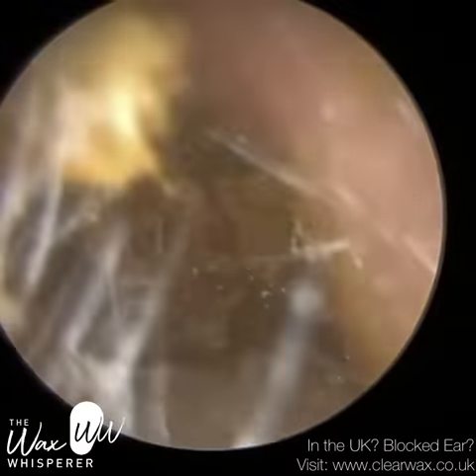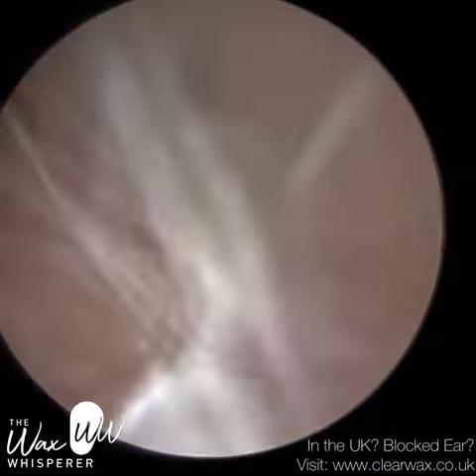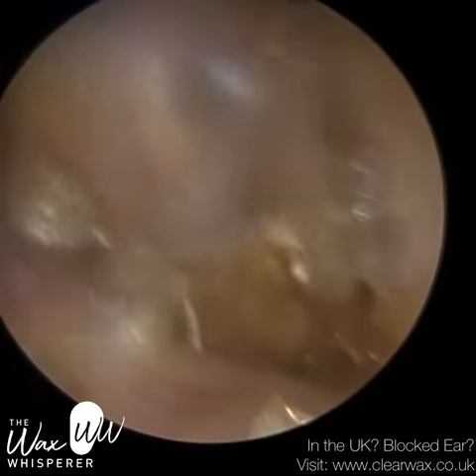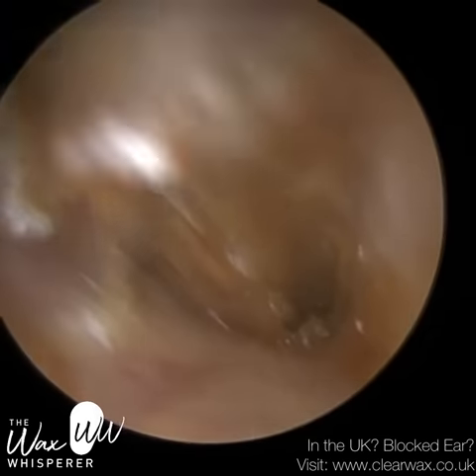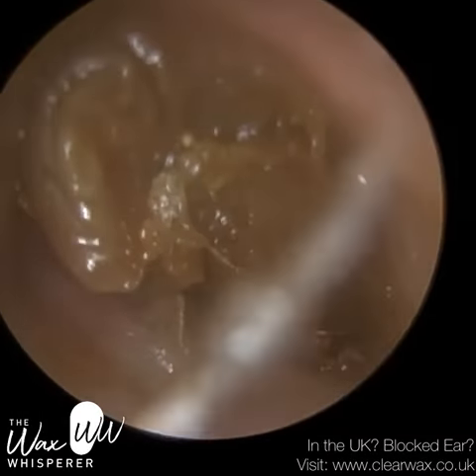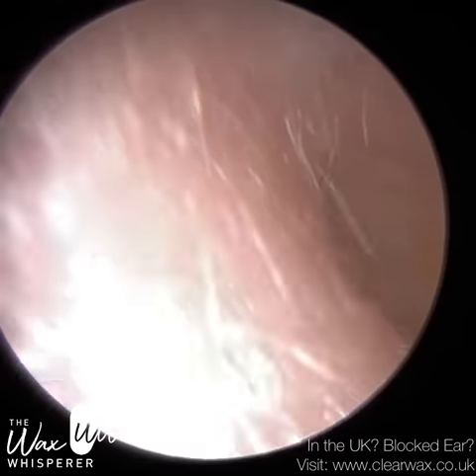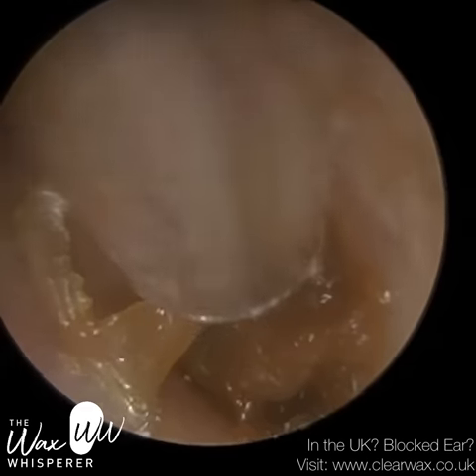Although air can enter the outer part of the ear through the entrance of the ear canal, for air to enter the middle ear it has to travel up the nose and then up a tube called the eustachian tube. The eustachian tube is a small tube that connects the middle ear cavity to the back of the nose — the nasopharynx. It's typically closed at rest, but during the day, completely involuntarily, when we swallow, yawn, or chew, the muscles either side contract, causing it to open. Air can momentarily enter or exit the middle ear to equalise pressure, and any fluid that has accumulated behind the eardrum can also drain out.